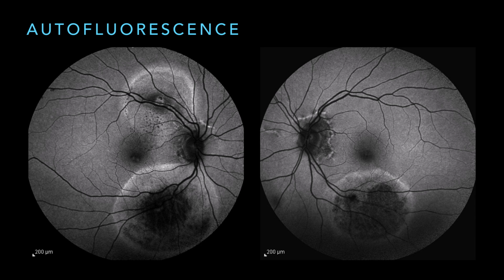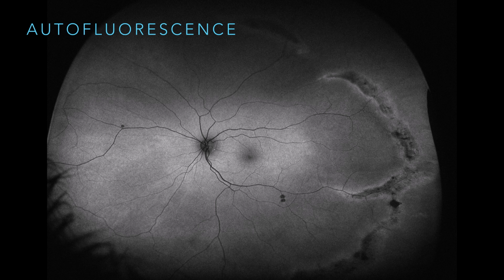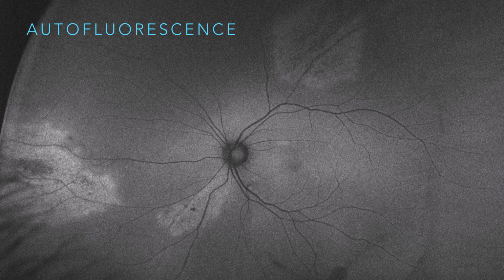Patient with high blood pressure, 70-year-old woman. She has bilateral retinal arterial macroaneurysms. And so I thought these pictures are beautiful. This is a patient of mine, the mom of a couple of boys that all have the same problem. They've got Stickler, and so this is just a great way to kind of show it.